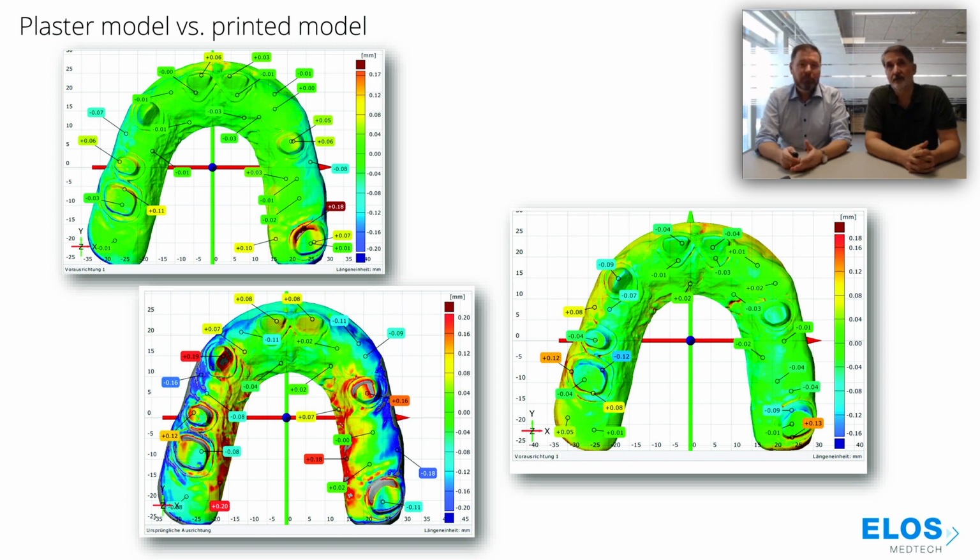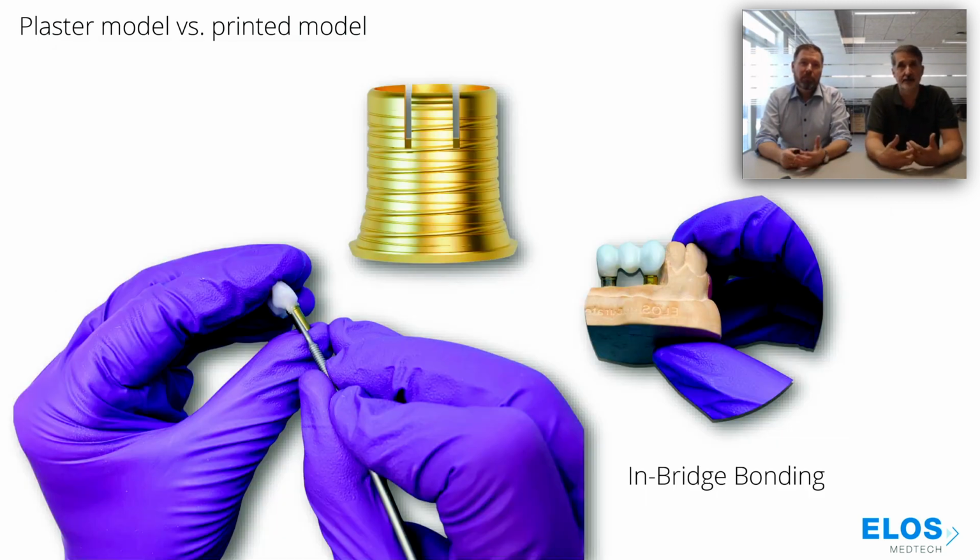Yeah, so as we just said, it depends on a lot of different factors. For multi-implant construction, I would always prefer either direct intraoral bonding, which might not be easy and not the best way for each case, because everything is wet and you have to dry it. But you actually get a full passive fit, so theoretically it's the best process.